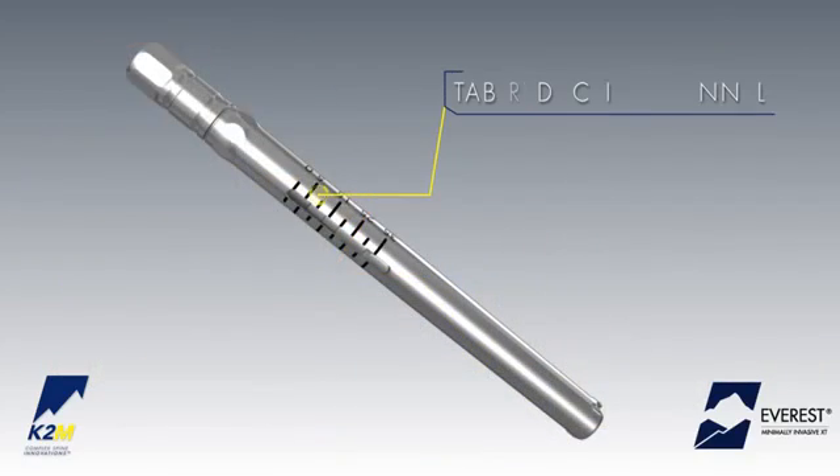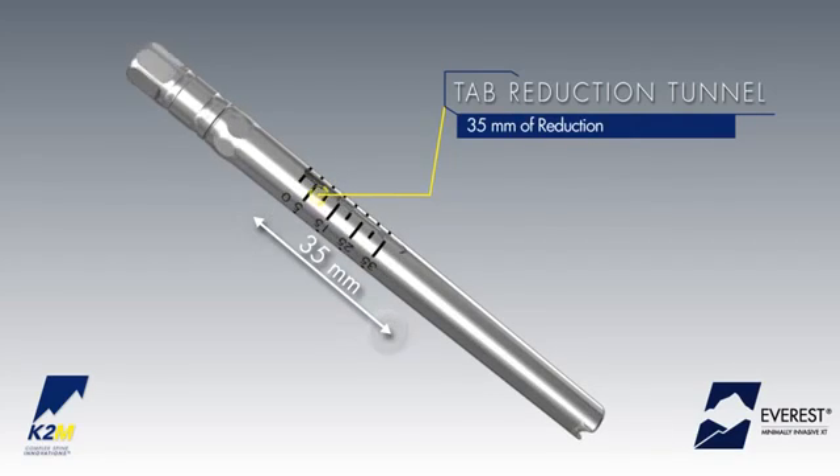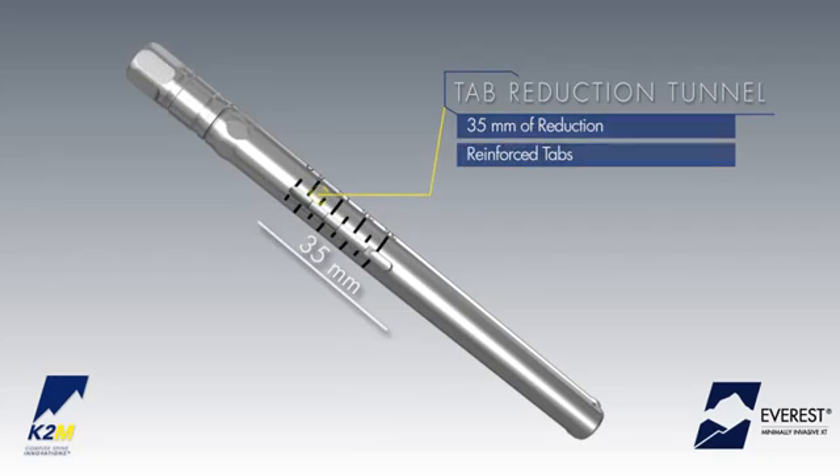If more than 25 mm of rod reduction is needed, the tab reduction tunnel may be utilized to provide a total of 35 mm of reduction while simultaneously reinforcing the tab.